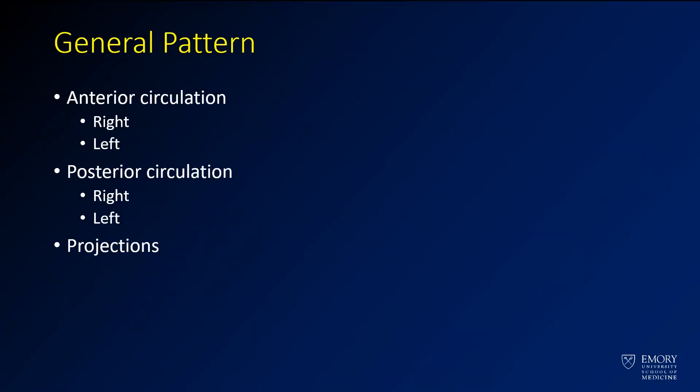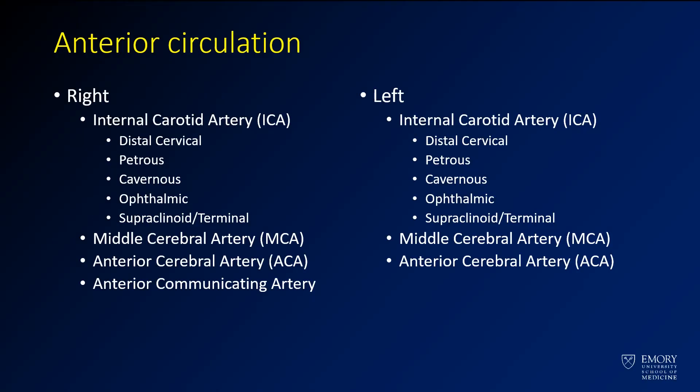In general, when I approach an MRA, I start from the anterior circulation first, moving from right to left, then I move to the posterior circulation moving from right to left, and then I take a look at some of the three-dimensional projectional data. When I work through the anterior circulation, I work from right to left. I'll start by looking at the internal carotid artery and its branches — the middle cerebral artery or MCA, and the anterior cerebral artery or ACA — and then I'll look for the anterior communicating artery. Similarly, I'll move to the left and follow the same pattern.